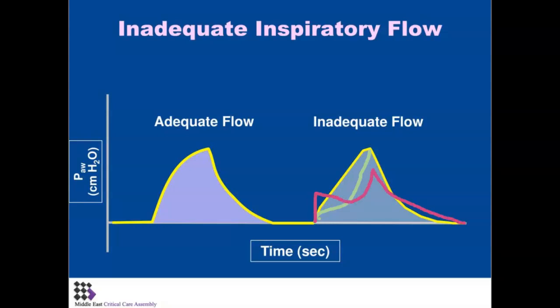Okay, if you ever see this on your pressure waveform, this is a huge big red flag, and it's just like this patient wants more flow. Because what's happening here is this patient could have triggered this breath if there was a little negative depression down here. But what's happening is that they're getting this breath, but if they're getting enough, they're not going to be making much more effort throughout the delivery of this pressure. But if they're not getting enough, they're going to start trying to keep sucking in, keep triggering the breath or the ventilator to try to give them more than what the ventilator wants to give them.